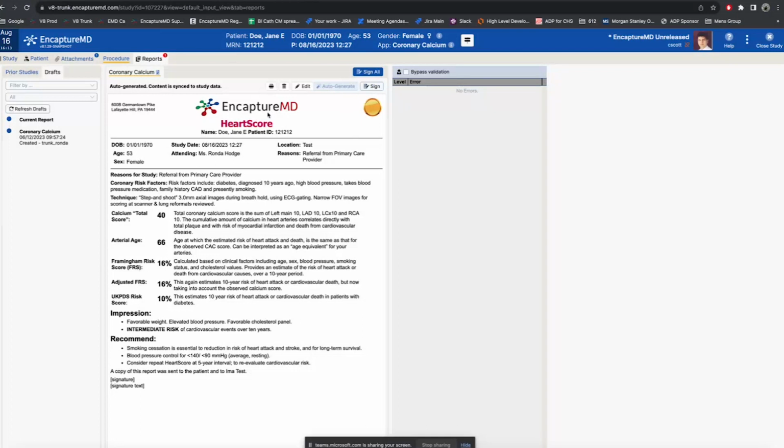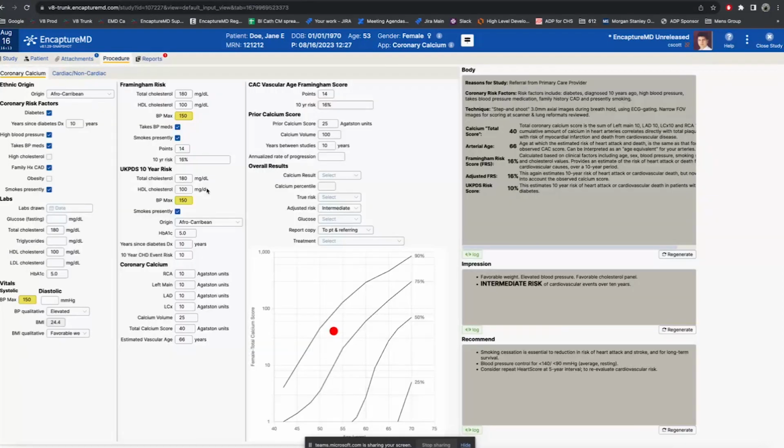So what was the question? What was the specific question on coronary calcium? Rhonda, did you have that? Yep. It was, how do you recommend getting that report into NovaPACS? So all the reports that are created will go back to NovaRad. So they'll also be routed to the ordering system as well by whatever mechanism is required for your facility.